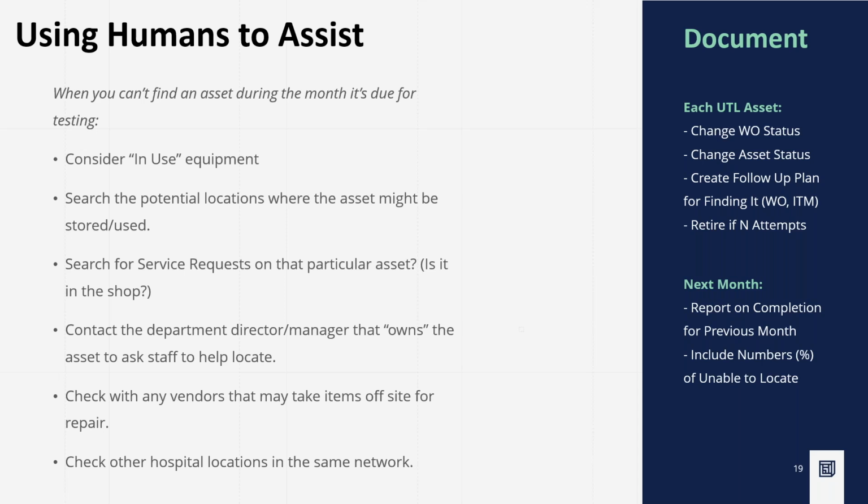A lot of it is making sure that the clinical staff knows not to take an out of compliance asset and use that to hook it up to a patient. Or do you leverage technology and integrate your existing solution into something like ADT codes, so that when that patient gets discharged, you can automatically flag that asset, and send an alert to the team to let them know that they need to pick it up and perform the PM.